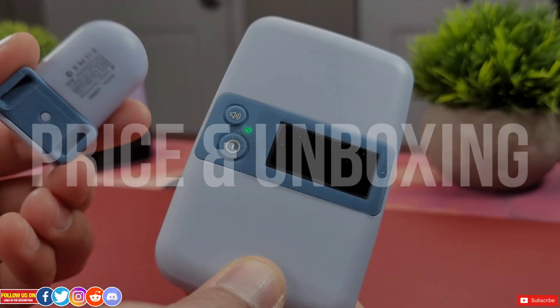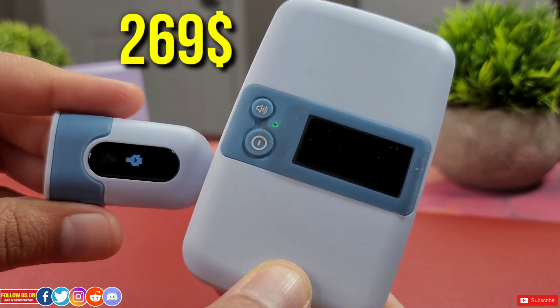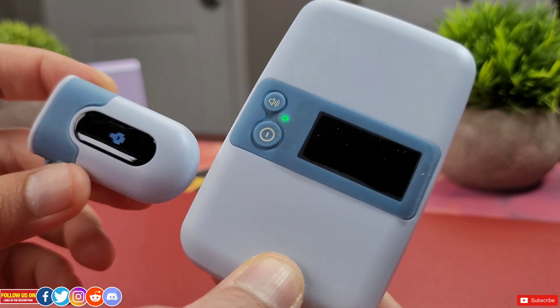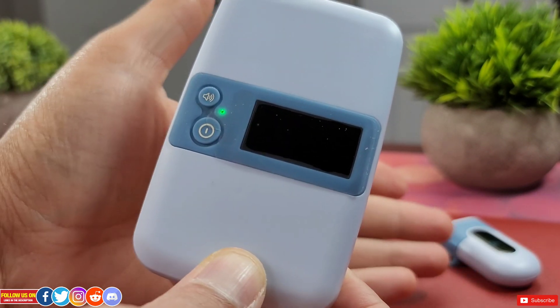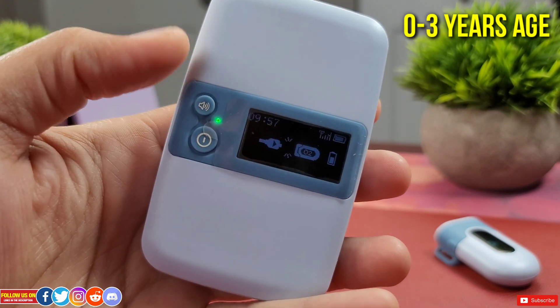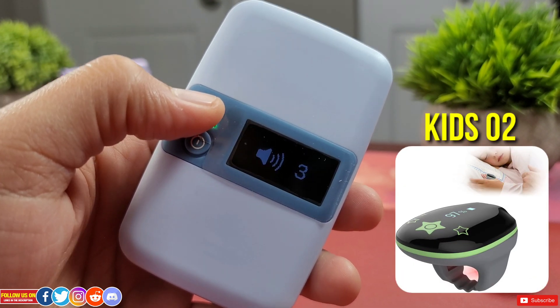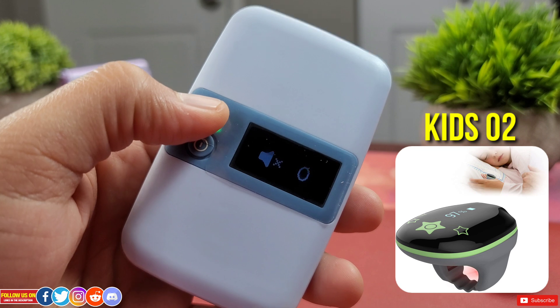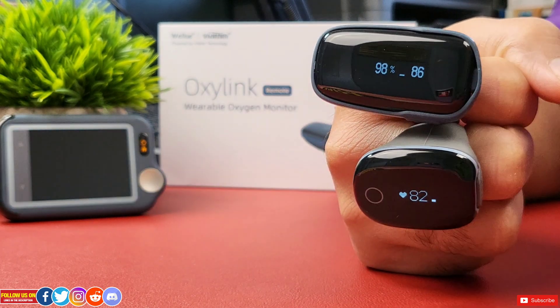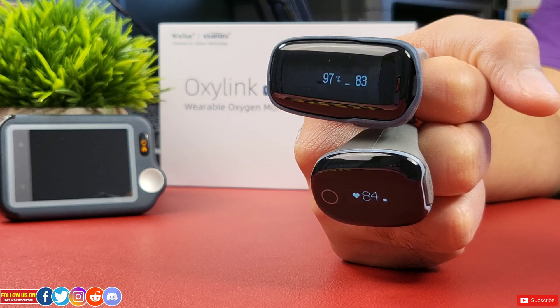Starting with price and unboxing: the Baby O2 S2 oxygen monitor is listed on their website for $269 USD at the time of filming — price may vary at seller's discretion. Check the video description for a direct link and any discounts. This product is intended for babies up to three years of age. For kids aged 3 to 10, check out their Kids O2 Pediatric Oxygen Monitor. They also have products for seniors and adults, with review videos linked at the end of this video.